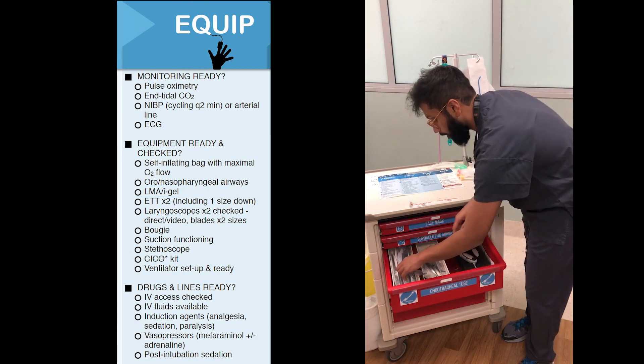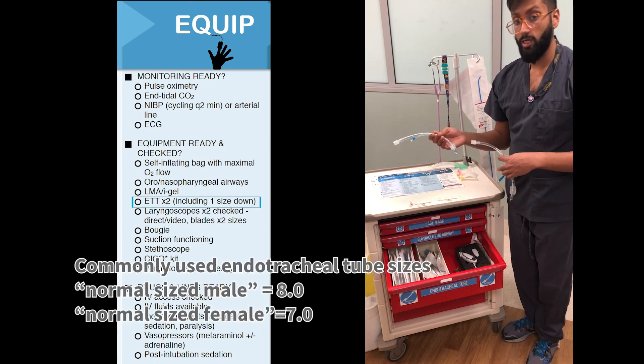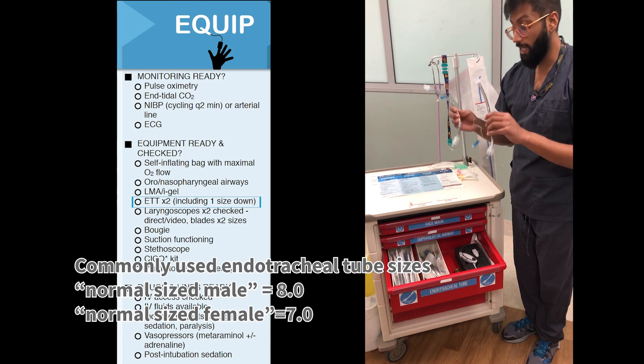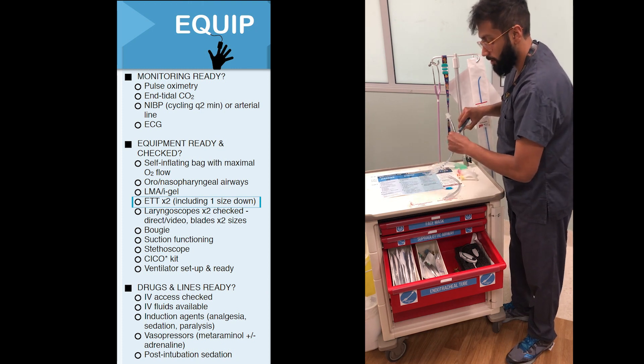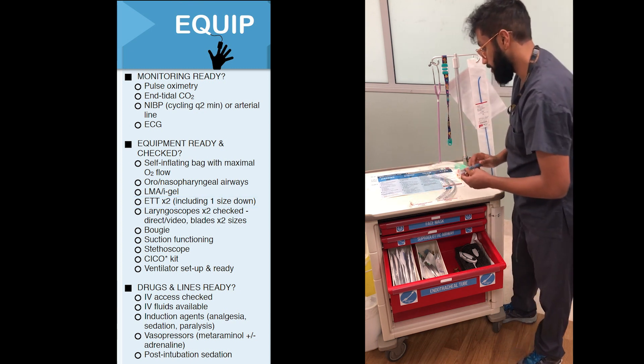The next thing you'll require is two sizes of ET tubes. The standard size we use for a normal adult male is an 8, and we always keep a size down, so we've got an 8 and a 7 here. It's really important to check the cuffs, making sure they're working and there are no tears in them, so that you don't have any problems when you're intubating your patient.